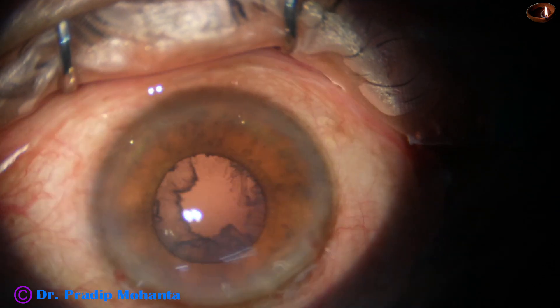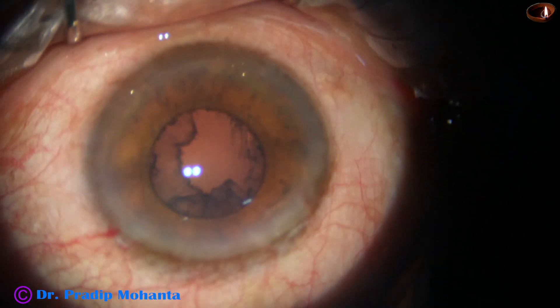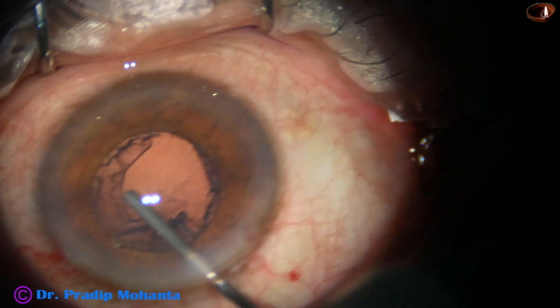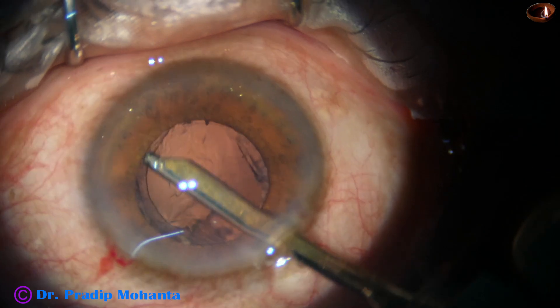I come out and inject viscoelastic. This part of the video — the nucleus management part — has been slowed down a bit, to 90% of real speed.